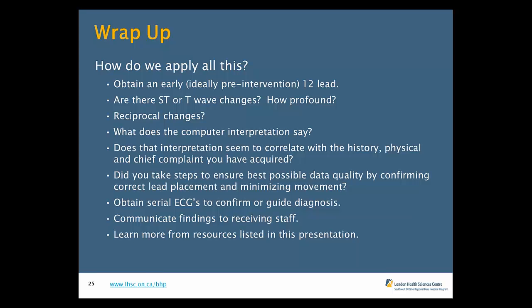Going through medical school and going through your cardiology rotations, cardiologists would just throw up the ECG, no clinical context, interpret this, and that's not how we work in the real world. We know the clinical context behind these ECGs, and that is huge when it comes to interpretation. It helps shape what you're looking for in that ECG. So again, we stressed it, the ECG is just one piece of the puzzle itself.